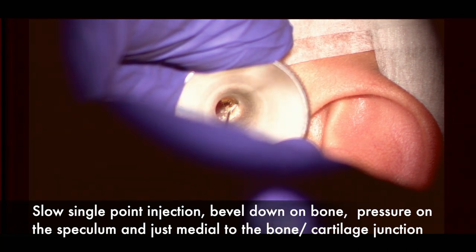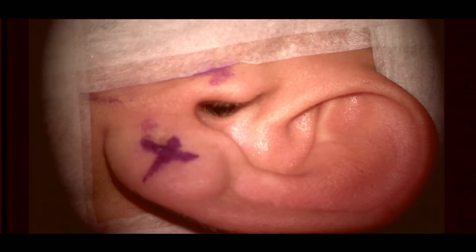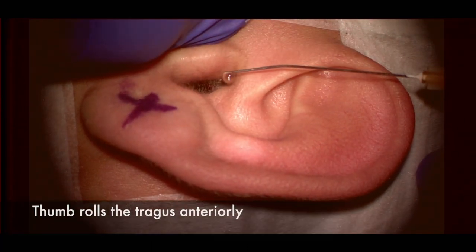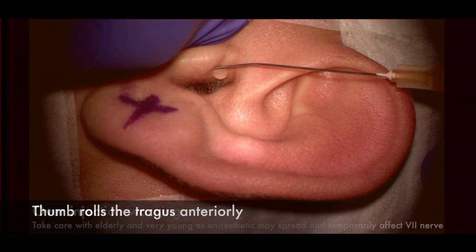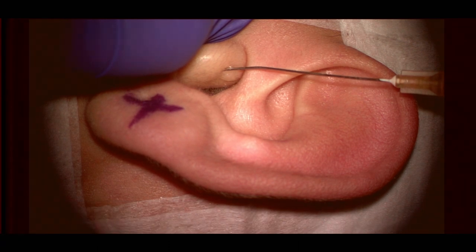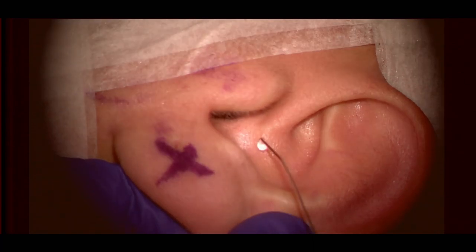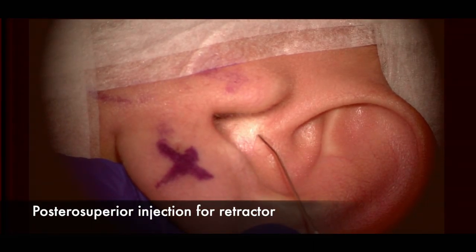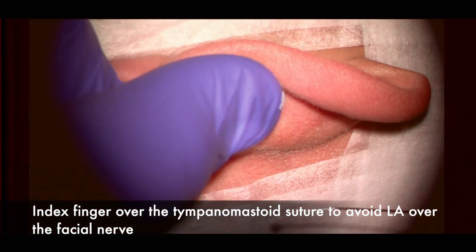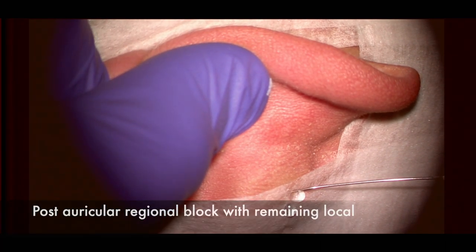The injection is done slowly. Attention then turns to the tragal cartilage — using the thumb to roll the tragus anteriorly, then injecting just under the skin between the soft tissue and the perichondrium. A small amount of local anesthetic is instilled in the posterior superior quadrant of the ear canal, and then a posterior regional block is applied with an index finger over the tympanomastoid suture to prevent local anesthetic from spreading over the facial nerve.